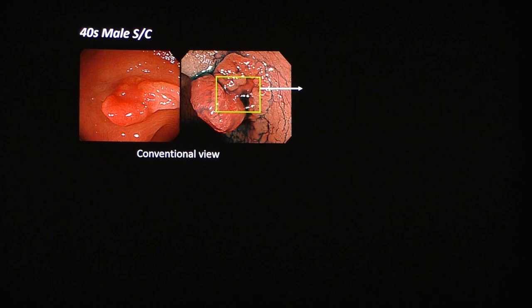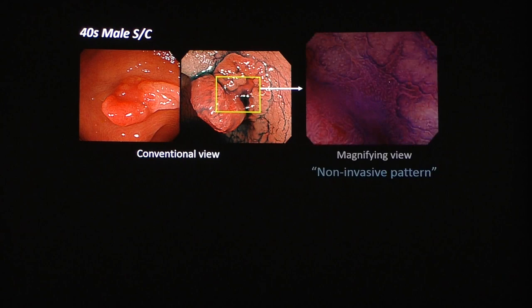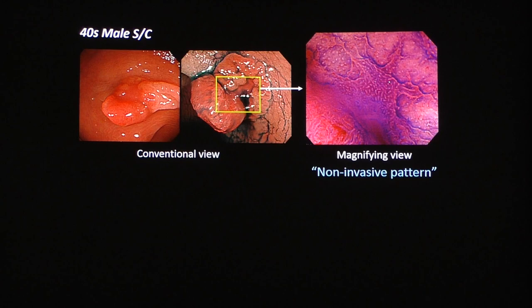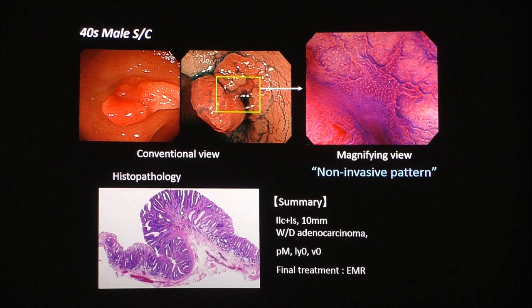How about this lesion? After spraying Indigo Carmine, we can see a demarcated area inside the lesion. However, the difference from the previous case is the pit pattern inside the demarcated area. In this case, the pit pattern is not so severely irregular — at most a 3S pit or 3L pit. So this lesion has a demarcated area, but inside the demarcation we cannot see 5I severe irregularity. This lesion is negative for invasive pattern, and is considered to be intramucosal lesion or, at worst, superficial submucosal invasive cancer. Endoscopic resection was performed and pathological results confirmed intramucosal neoplastic lesion. Using crystal violet staining, very accurate diagnosis is possible.